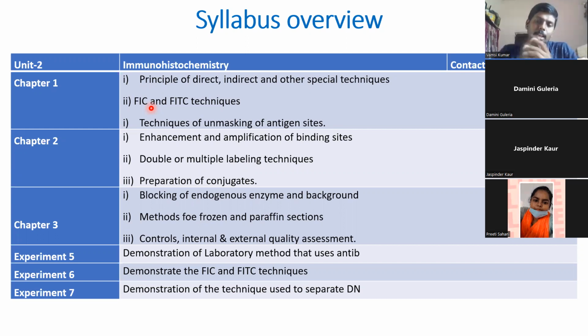This is called affinity. And the second one is avidity. Avidity means, upon attachment, how strong is the bond? Is it too strong or is it a delicate bond? Avidity will tell about the strength of the bond, whereas affinity will tell about the level of attraction towards the antigen. So attraction is affinity and bonding is avidity.